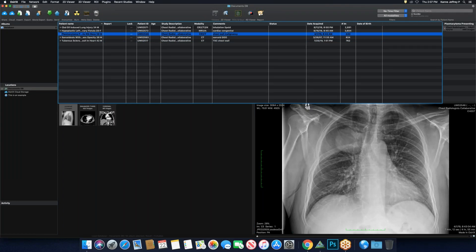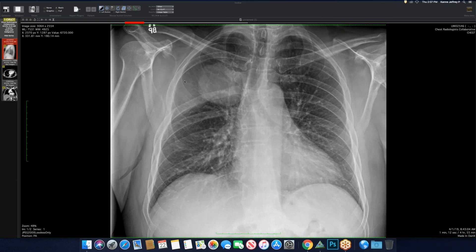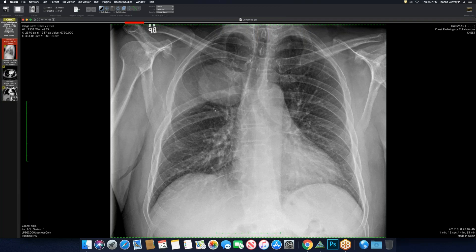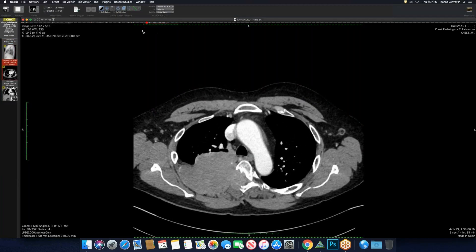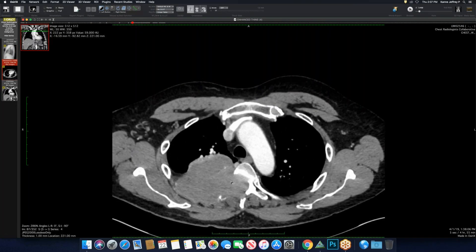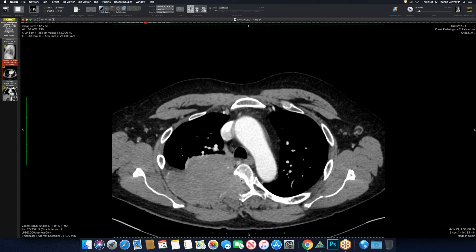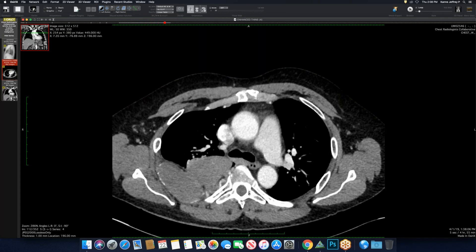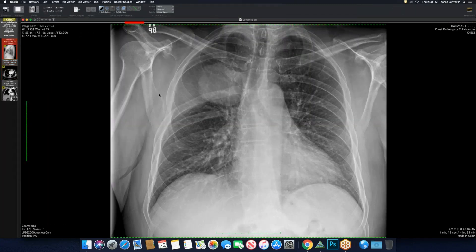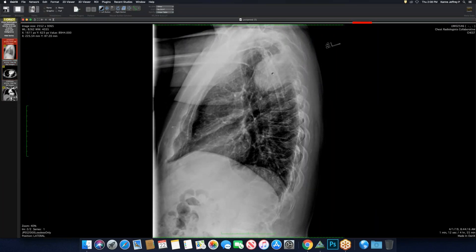This is a great resident or medical student case — a really pretty example of a mass. You can localize it even on the frontal view: well-defined, incomplete border laterally, and opacity lateral to it with a missing rib. You'd think of a metastasis, squamous cell, thyroid, lung cancer with bone involvement, or myeloma. This was not much of a diagnostic dilemma, but it's a really big mass here invading the canal. It ended up being a single plasmacytoma — massive, with a large extra-osseous component extending almost like a malignant nerve sheath tumor into the spinal canal. On the lateral, you can see it forms a fairly obtuse angle with the chest wall.